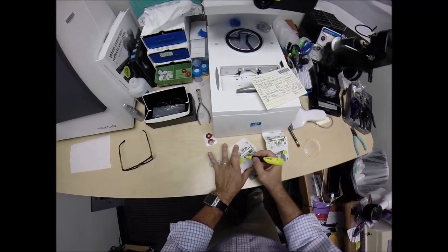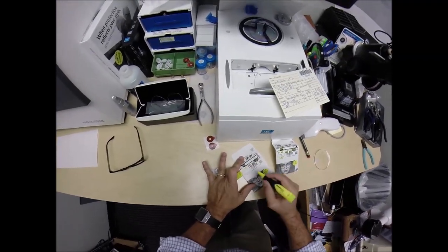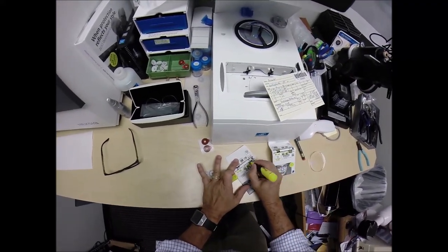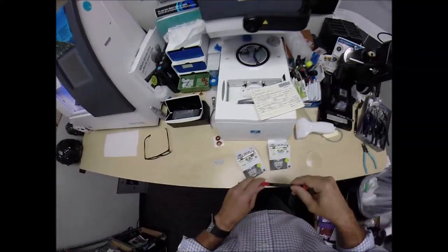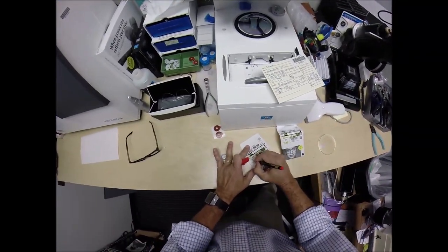Let's mark the left lens: single vision, aspheric — and I'll explain what that means a little bit later — DuraVision Platinum, the 1.67 lens. And this is the left lens.